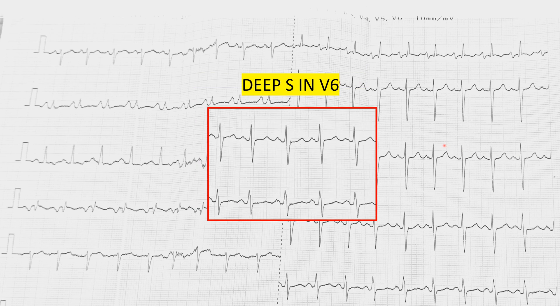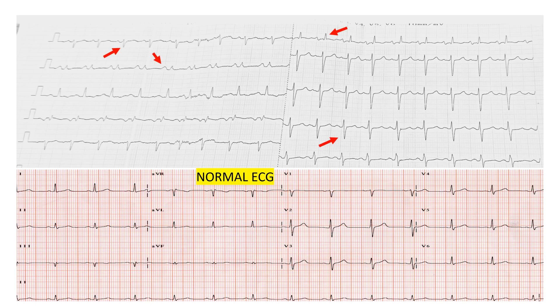Moving further, here is a finding that is not commonly looked for but should be kept in mind whenever right heart pathology is suspected. There should be a deep S wave in lead V5 or V6. In a normal ECG there should not be a deep S wave like this one, but here we can clearly see very large, deep S waves.